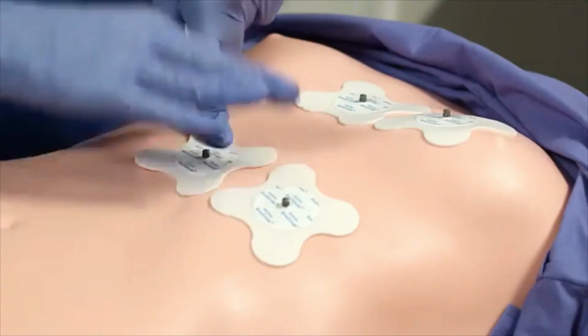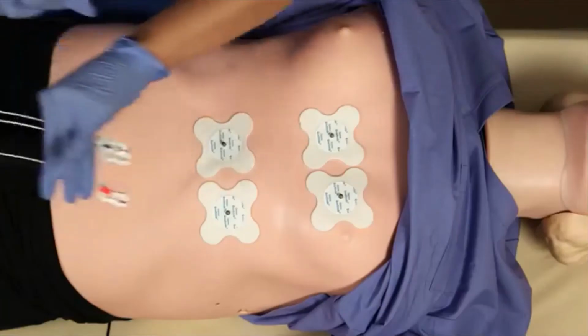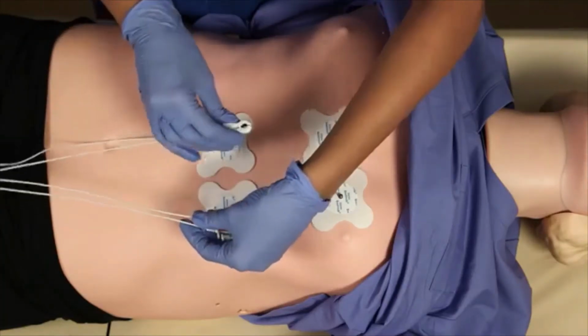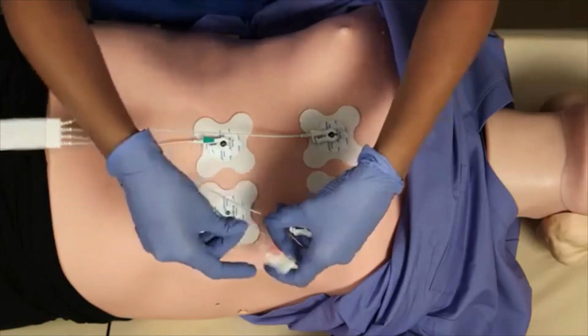If you prepped your patient correctly and placed the quattrodes but are still not getting the QRS high enough in relation to the reference line, there are a couple of things you can try.